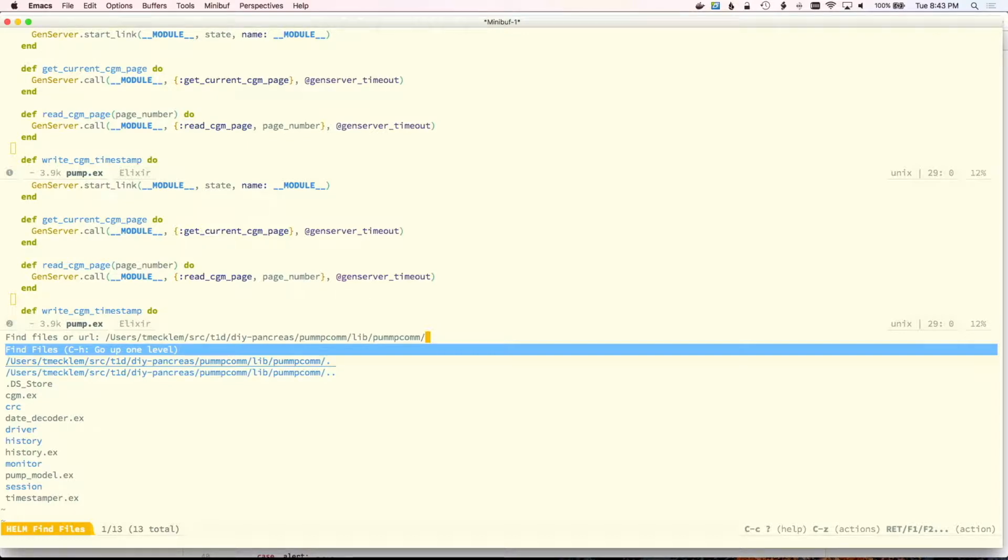Inside here, the project is broken up in a number of different ways. One of the things is how it's broken up at this logical session layer. And a logical session is basically communication that's ongoing with a pump.